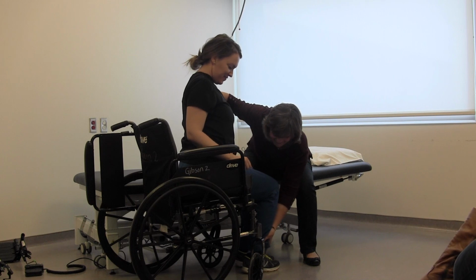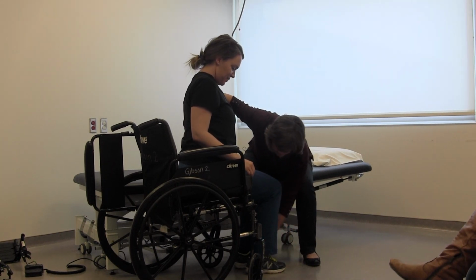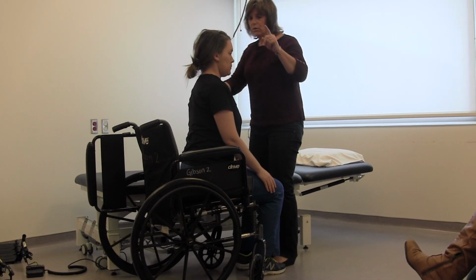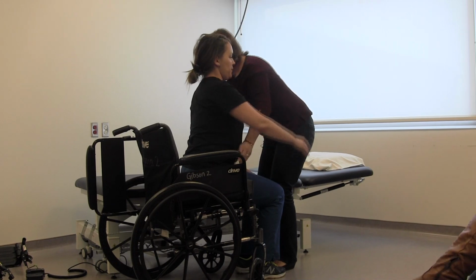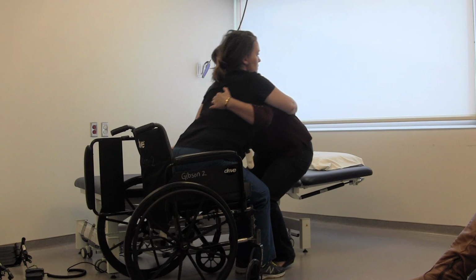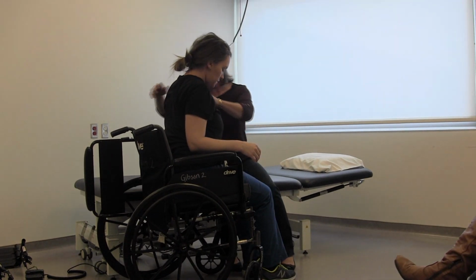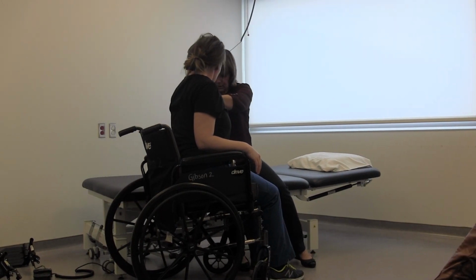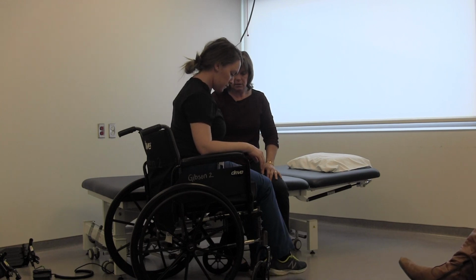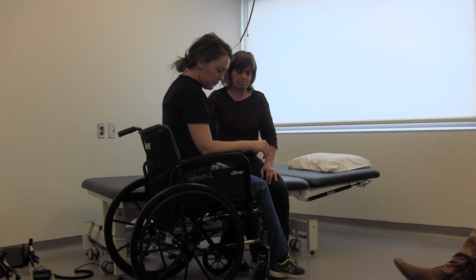She's getting ahead of me. She's a really good patient. Let's move this foot over a bit. Okay? So this time we're going to go to the right. And we're also going to go back a little bit. Okay? So bend up and back. There we go. And then from that position, we can flip this back. She might be able to wiggle herself back, right? And if I put the foot plates on, most of the time they can wiggle back as well.